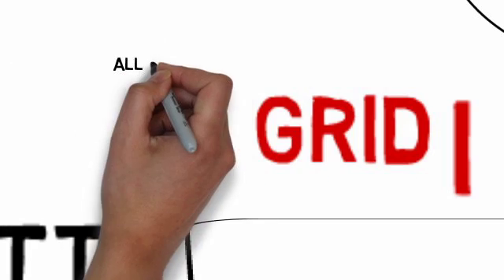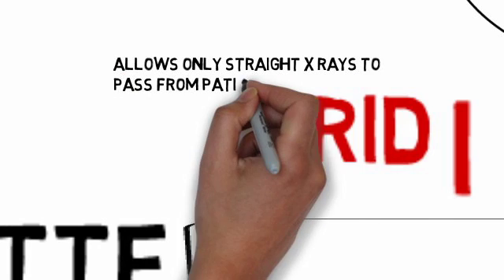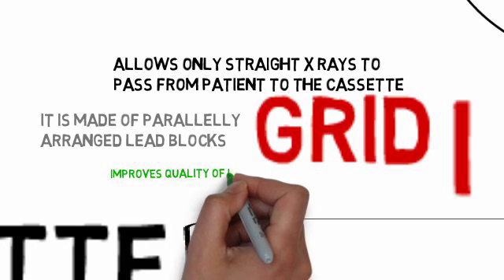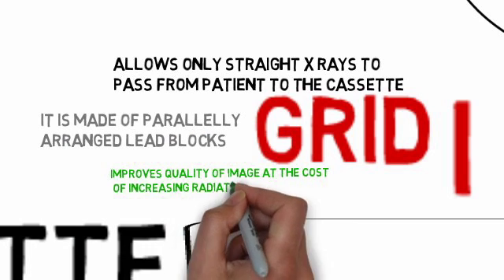This is the grid. Grid allows only straight X-rays to pass from the patient to the cassette. It is made up of parallelly arranged lead blocks. It improves the quality of the image at the cost of increasing radiation to the patient.